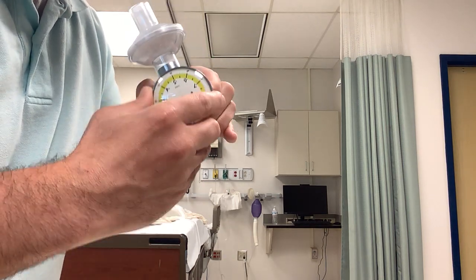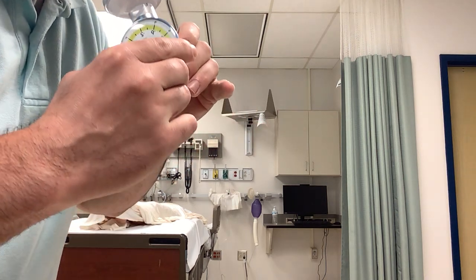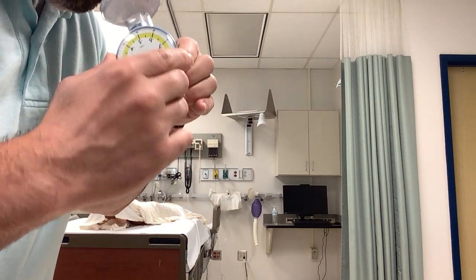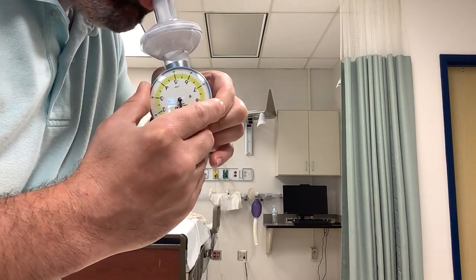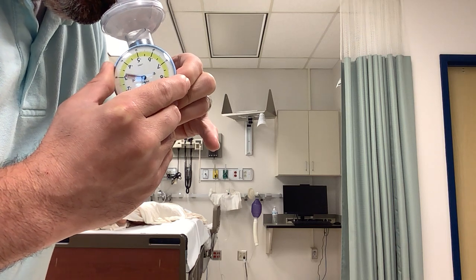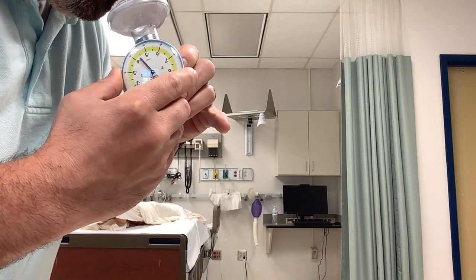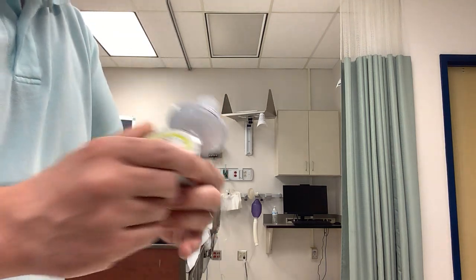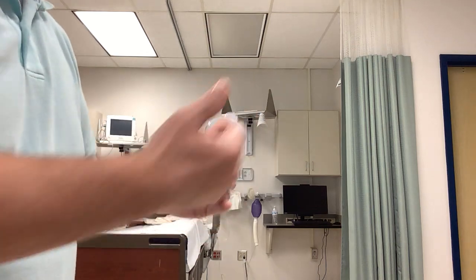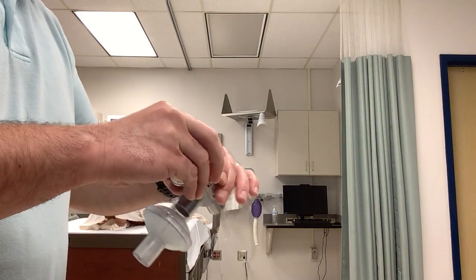Or you can also do it this way. Take this in the off position, have your patient breathe in a few times, and then when you're ready, slide that to the on position, and then at the end of your minute, slide it back off, because if you leave it on and you move this direction, it's going to pick up some flow, so that's going to add a little bit of volume to the breath that the individual didn't take.